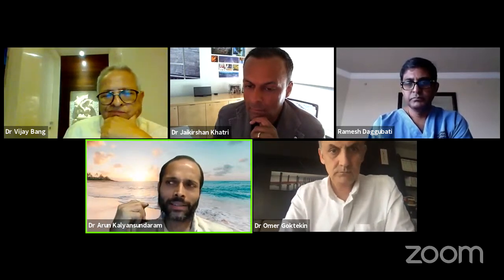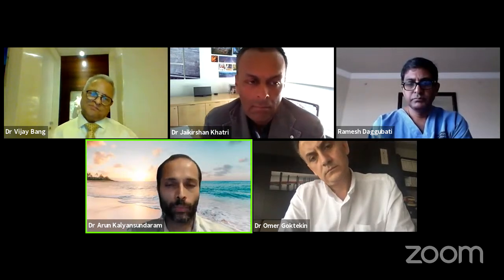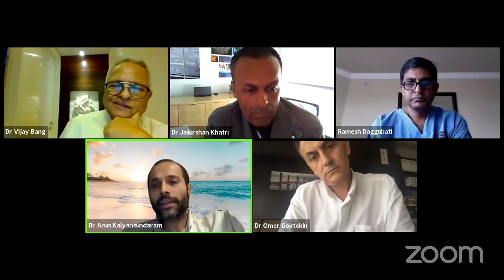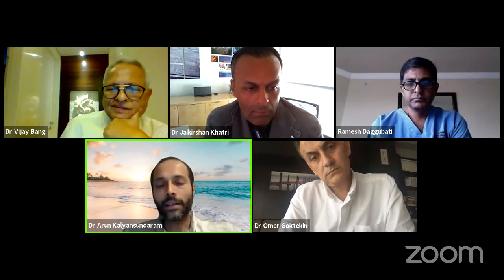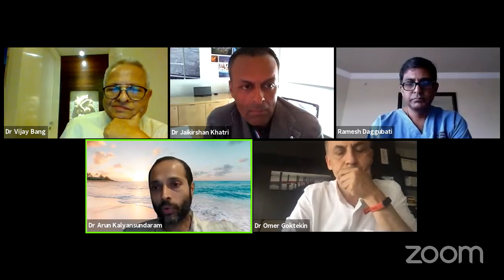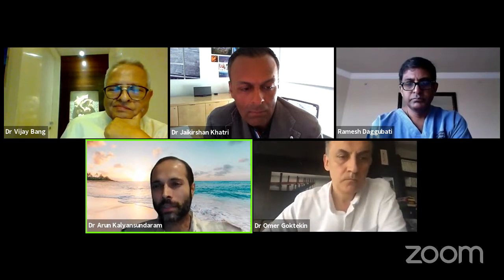And again, there are some cases where you're kind of running out of options. I mean, star, and you might just want to say, am I going to take this crazy, the case that Omer showed, right? If, let us say, he couldn't open the graft, for whatever reason, instead of taking that LIMA, LAD, and that epicardial, you might want to consider just starring that patient. You already have a hematoma, just star into the PD, bring them back a couple of weeks later and reattempt. I think that would be a prudent time to say, hey, I'm not going to stent you now, but it's okay to stop.